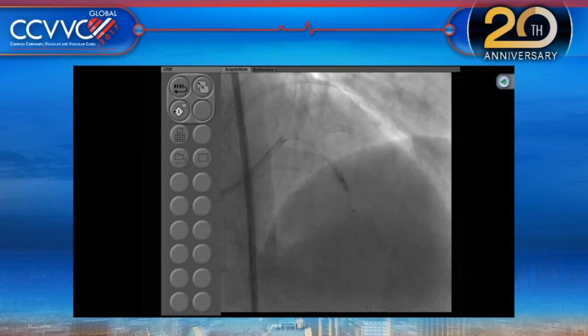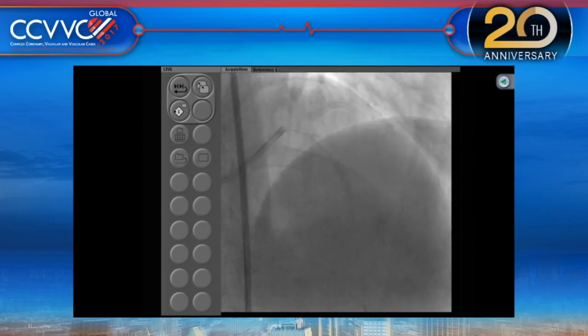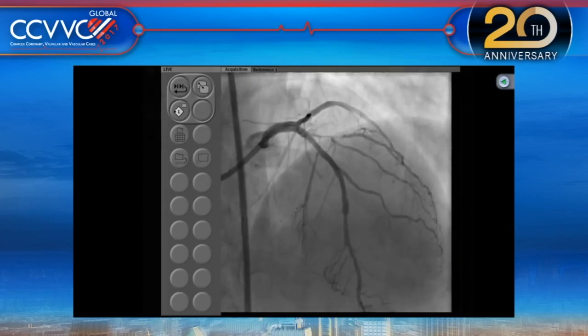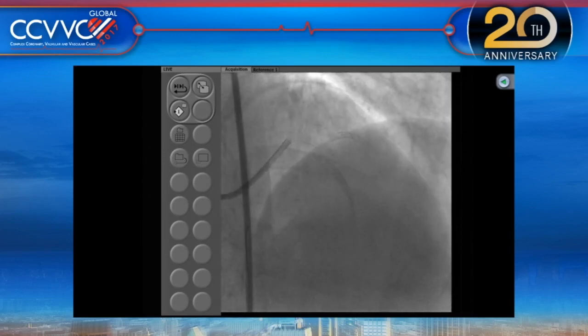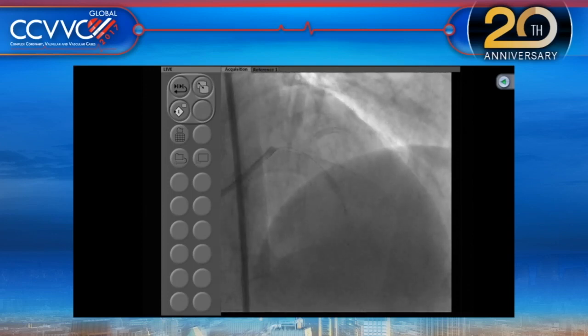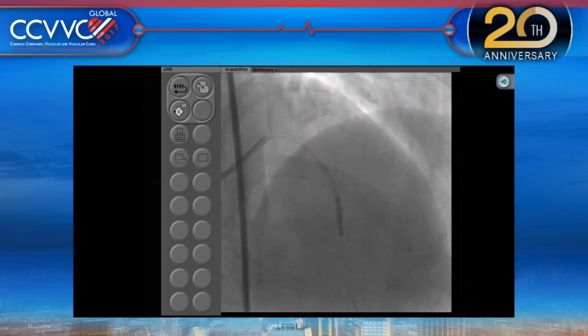Yeah. Dr. DiMarcina. Yeah, the other thing is that the branch isn't huge, the diagonal isn't huge, but it does have a beautiful angle for the Triton stent. So this is actually also attractive. Normally, I would be going exactly like Dr. Sharma's doing, except the rotoblader plus minus, but now with the Triton stent, with this type of angle, I'm leaning towards that. How is that better than ballooning in a small vessel, because it's a bare stent?